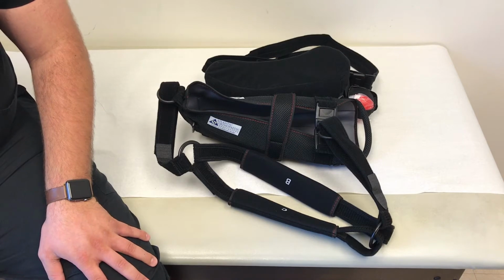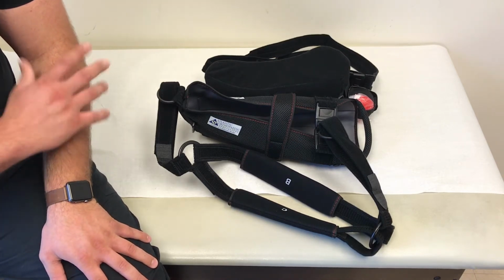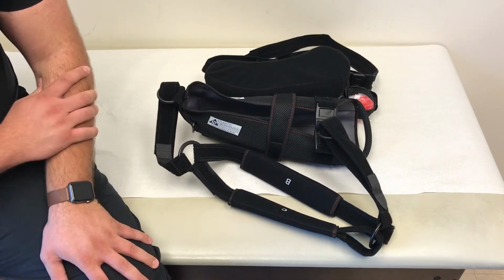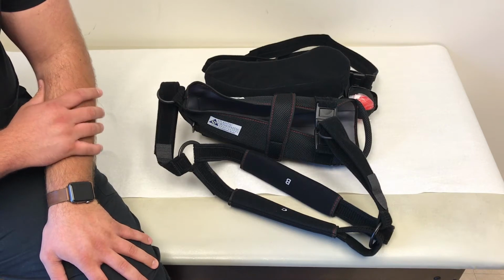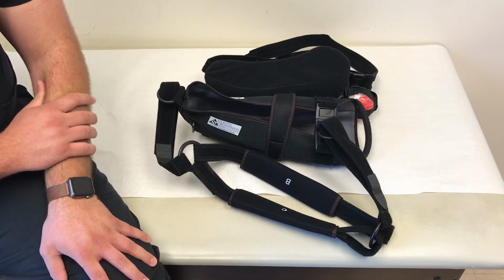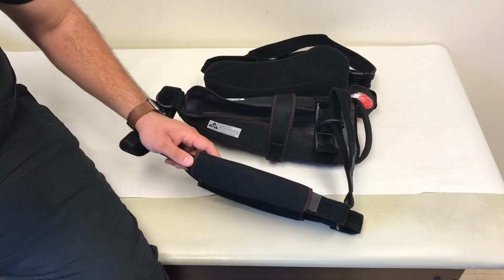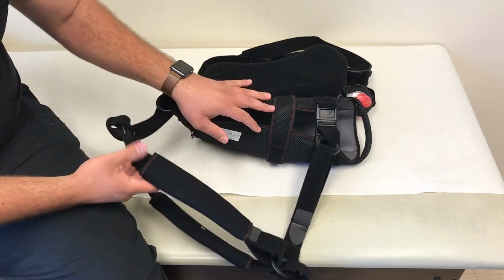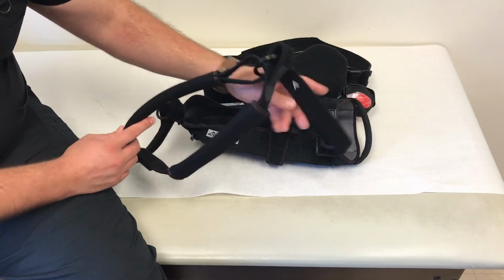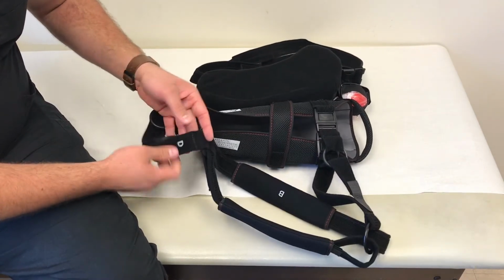Okay, so next I'd like to review some of the anatomy of the DonJoy Ultra Sling IV, as there are several components here, but once you get more familiar with them, you feel extremely comfortable with how it all works and why it works the way it is supposed to. So just reviewing, you do have 4 straps that go about the arms that help support the surgical arm. You have straps A, B and C, and strap D.